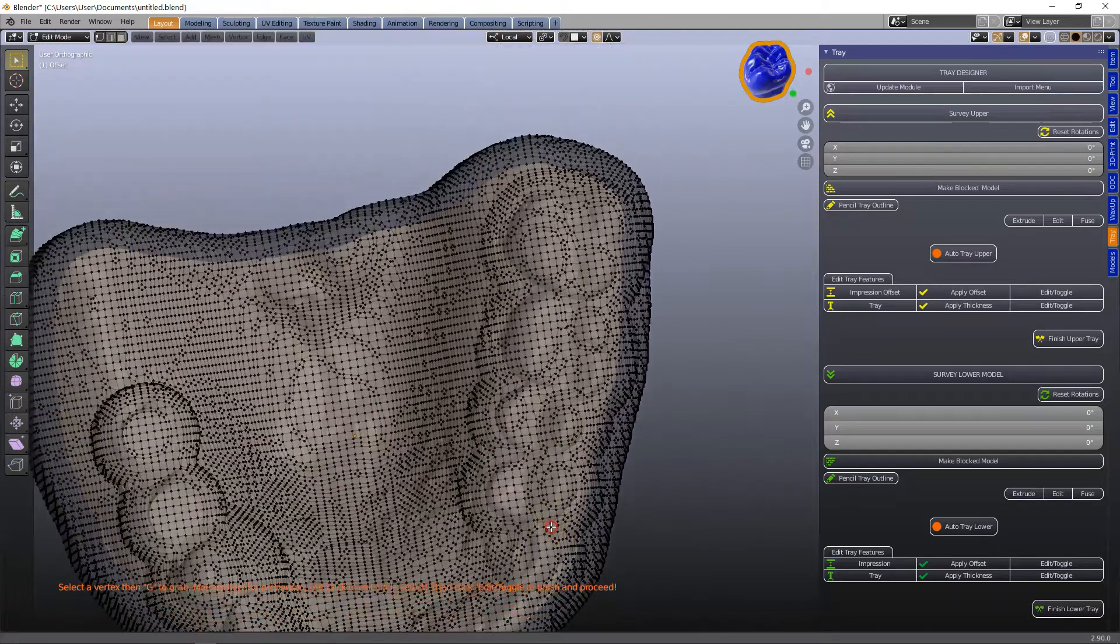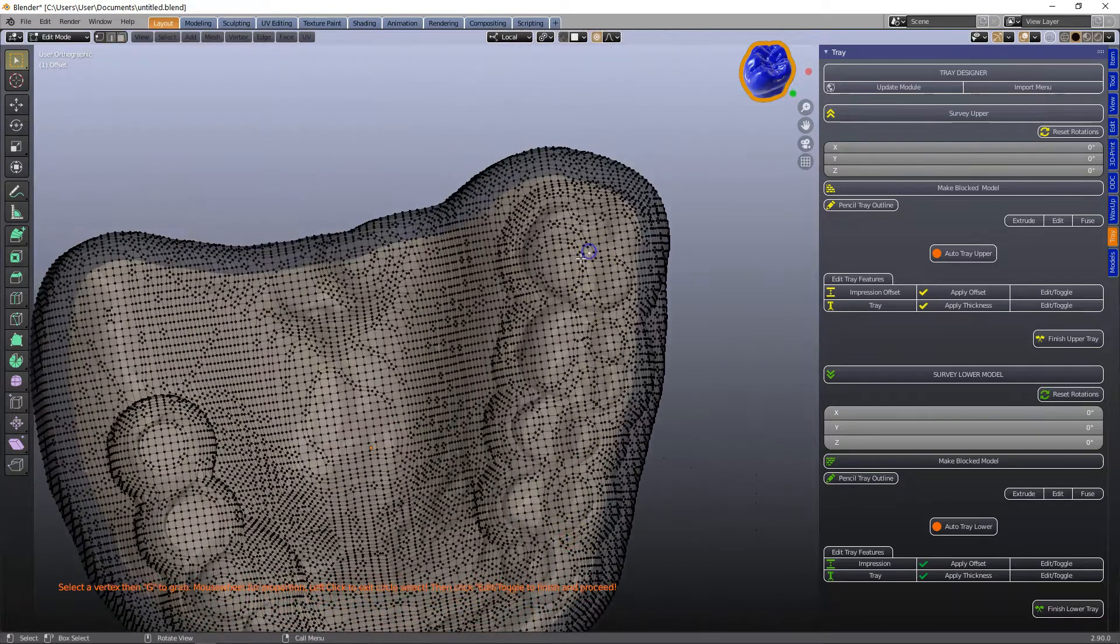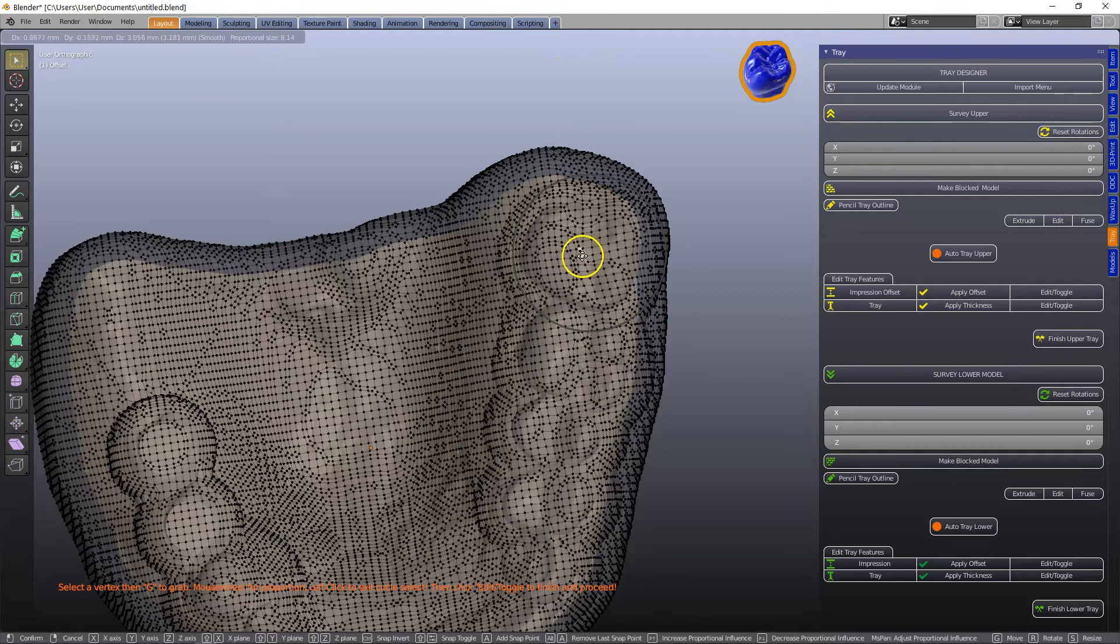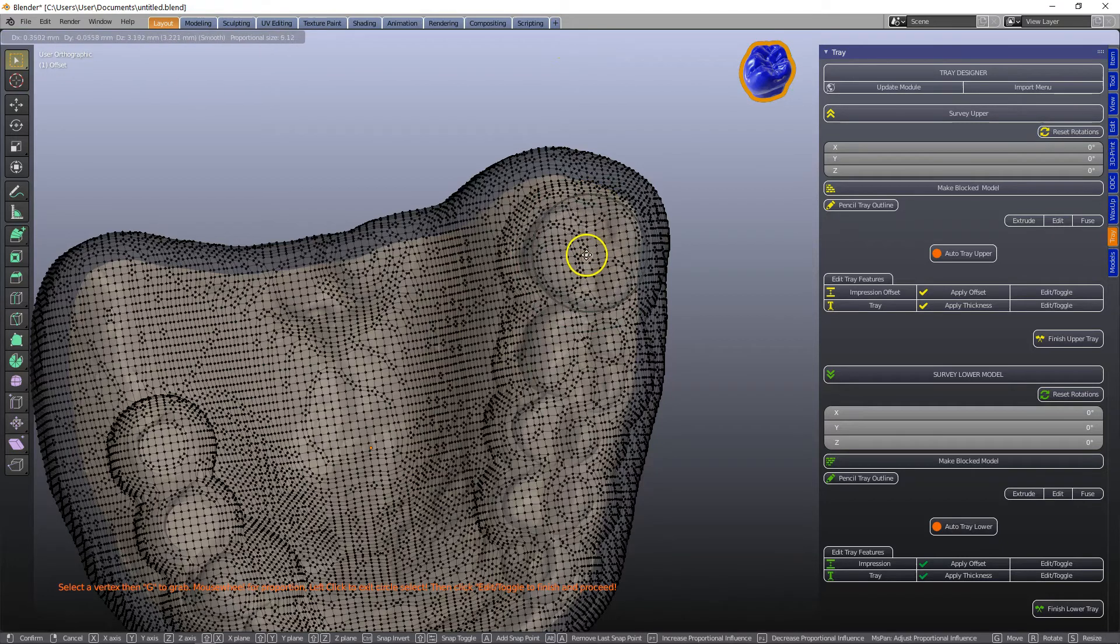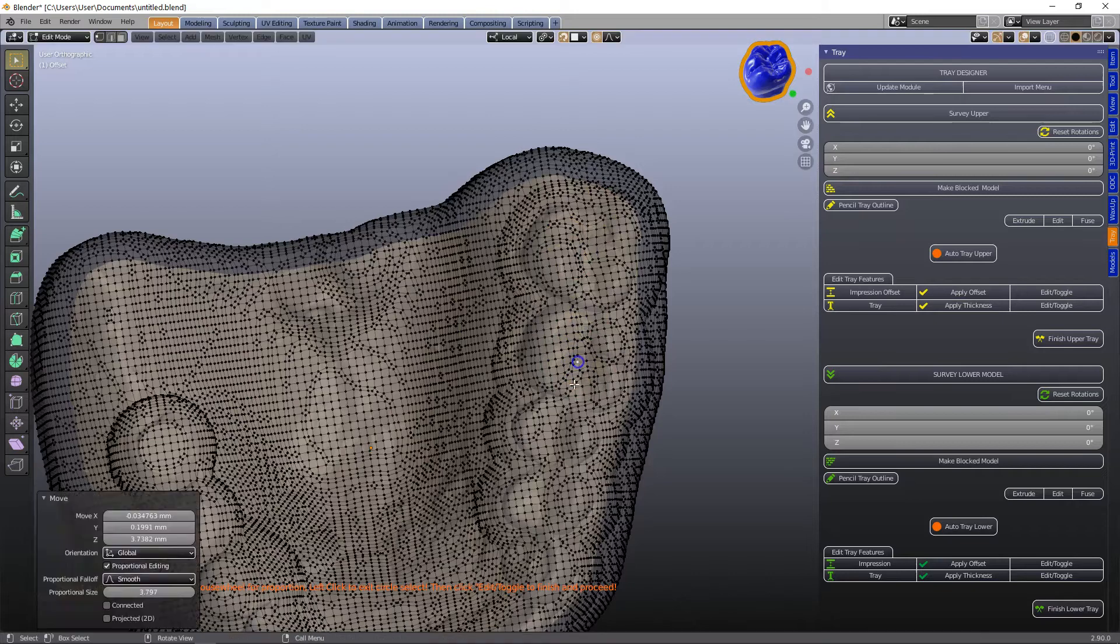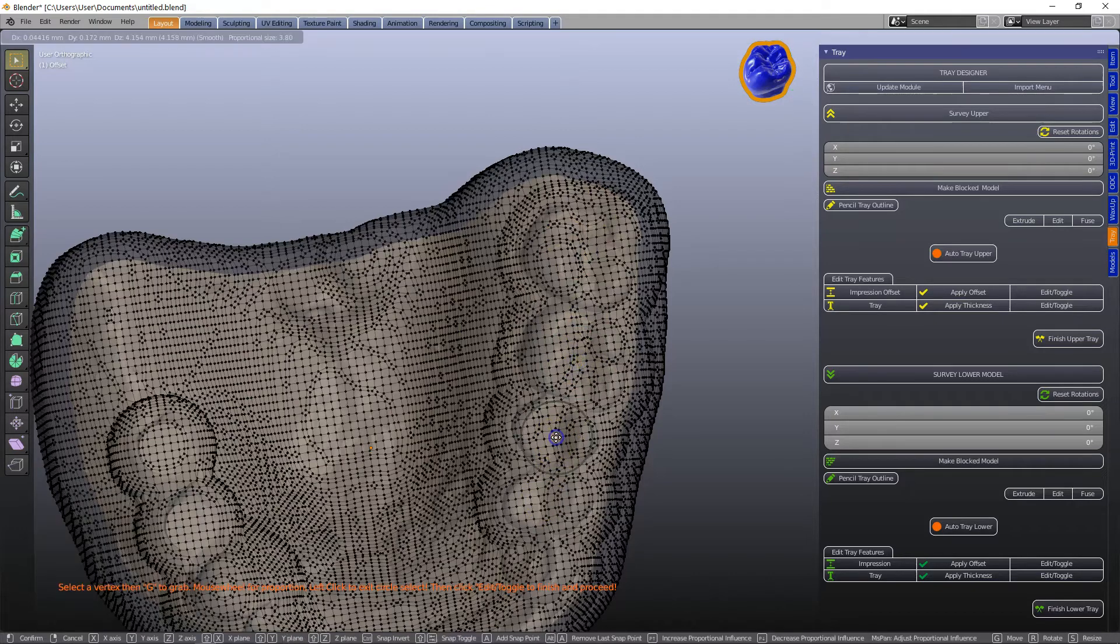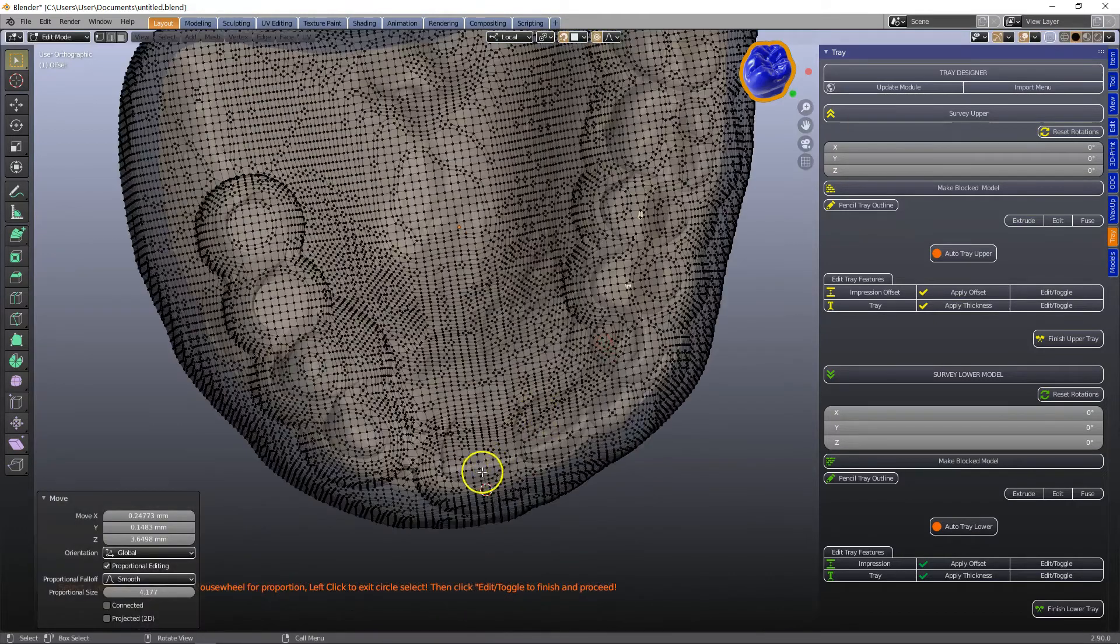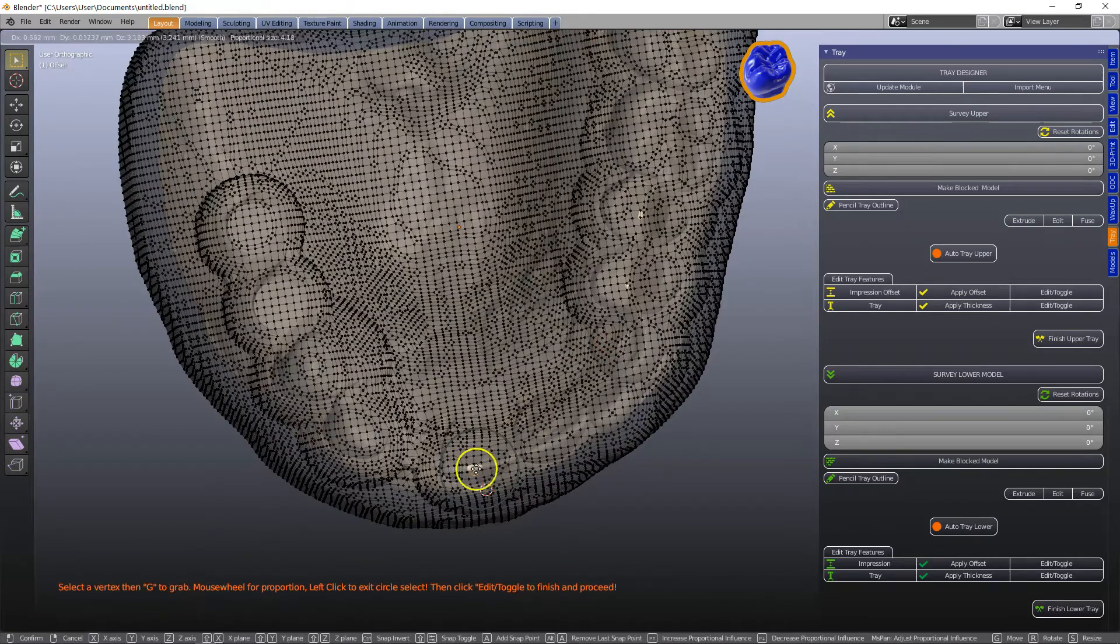So here I'm going to be making occlusal stops. So make sure your magnet snap tool is on and proportional editing is on. Select the vertices and then G to grab and that snaps it to the underlying model.